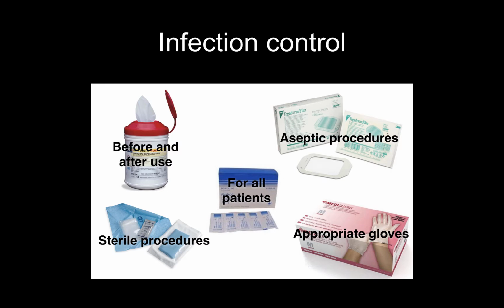So first, just some practicalities. Ultrasound machines are notoriously dirty, and as they travel from patient room to patient room, they pick up a bunch of nosocomial organisms. So here's a few things that we could do to reduce the possibility of transmitting infection via the ultrasound machine. First of all, the ultrasound probe, the probe holder, and the keyboard should be disinfected before and after use. Never trust the person before you for having left the machine in a clean state.